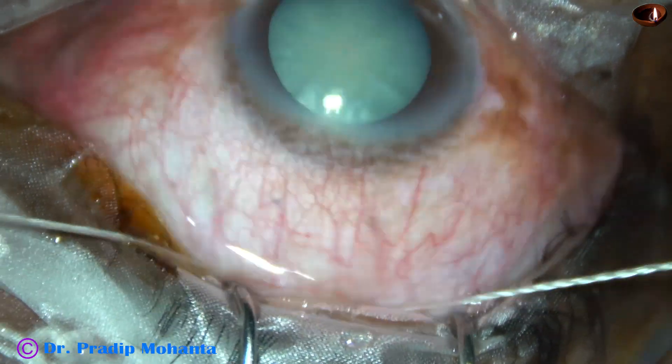I introduce the 23-gauge Simcoe through this side port and try to remove the cortex. There is very little cortex; however, some amount has come out. But there are a lot of cells sticking to the posterior capsule from 6 o'clock to 12 o'clock. To dislodge these cells, I use a hydro cannula and BSS, gently flushing BSS over the posterior capsule. The cells get dislodged.